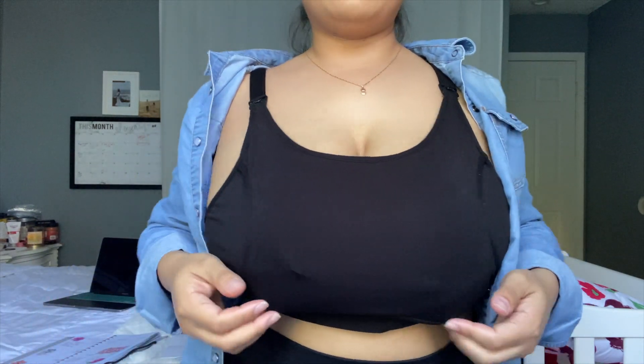It also comes with bra extenders, but I don't personally use them — I just wear my nursing bra and adjust the straps as needed. This is me with my pumps in right now; they've been going for about 45 minutes so far, since this is the second time I'm filming this video.